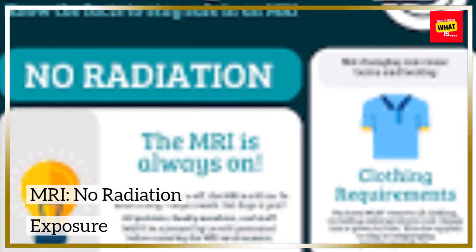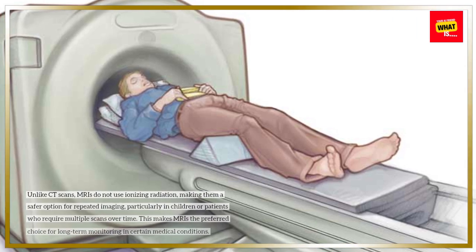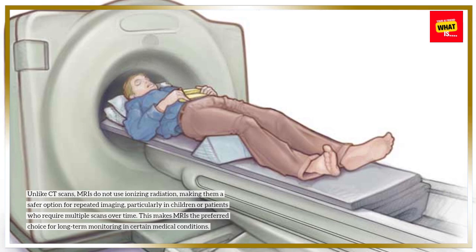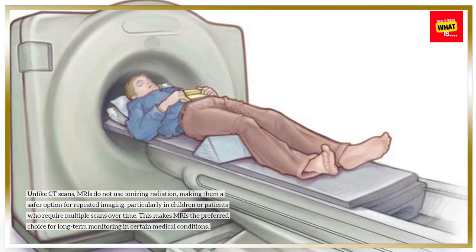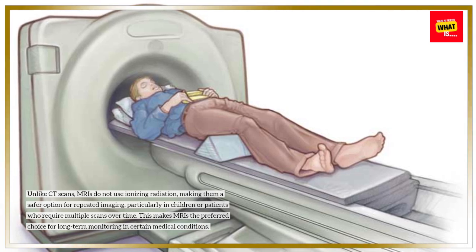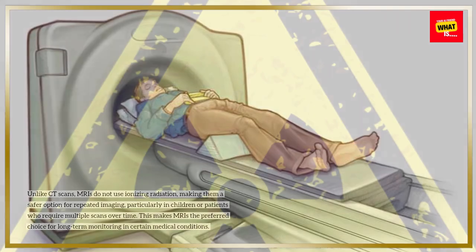MRI, no radiation exposure. Unlike CT scans, MRIs do not use ionizing radiation, making them a safer option for repeated imaging, particularly in children or patients who require multiple scans over time. This makes MRIs the preferred choice for long-term monitoring in certain medical conditions.